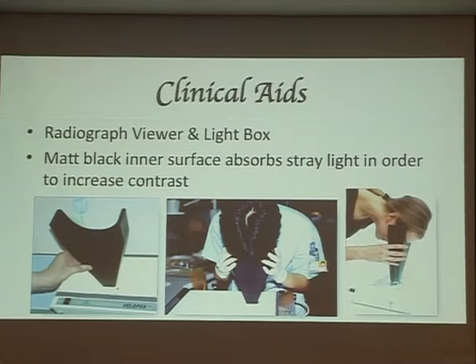Okay? And also, if you're still using the conventional X-ray, try to buy this X-ray viewer. It's very cheap, okay? I would say about $100 US. I can use it for life. You don't drop it, okay? You drop it, there's no guarantee. There's a 2 times lens inside. And you can block all those lights so you can see the details of the X-ray. For my students, they have to show me that they view the X-ray with this viewer before they ask me any questions. A lot of dentists do that, right? Okay. They say, oh, good. No, this is a more professional way to do it because you want to see more details.